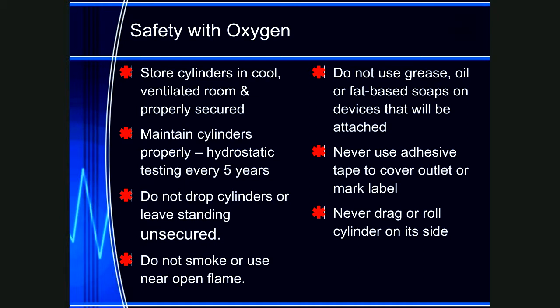We don't want to drop cylinders or leave them standing without having a hand on it. We don't want to smoke or use near open flame. Oxygen supports combustion. We don't want to use grease, oil, or fat-based soaps on the device that will be attached to it. We don't want to use adhesive tape over the outlet to mark a label. And don't drag or roll the cylinders on their side.